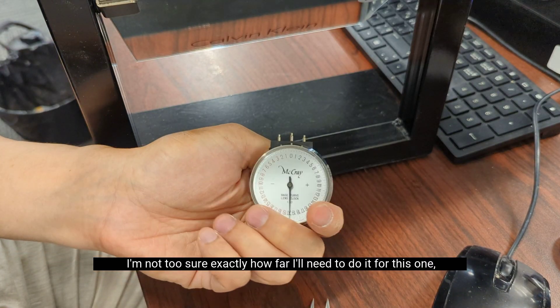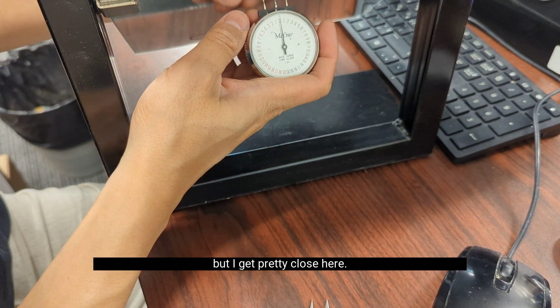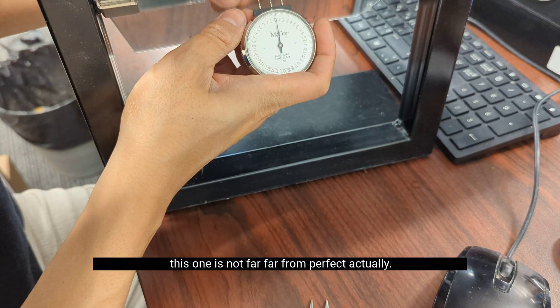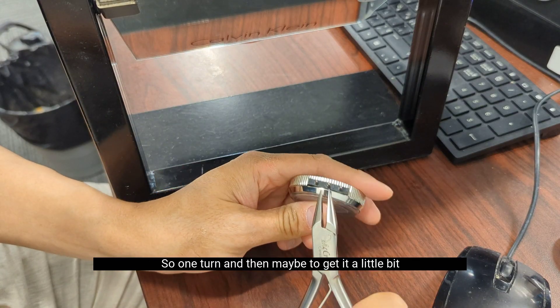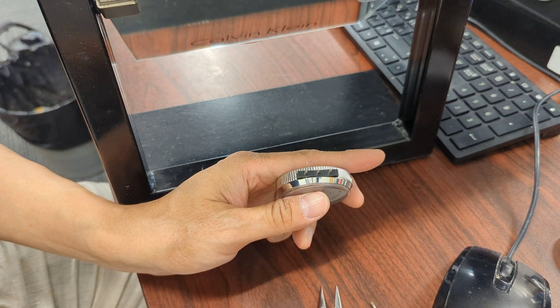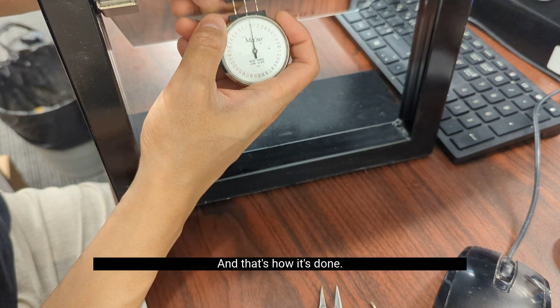I'm not too sure exactly how far I'll need to go for this one, but getting pretty close. Actually, this one's not far from perfect. So one turn, and then maybe rotate it a little bit more to get it closer to perfect. Yeah, that's how it's done.